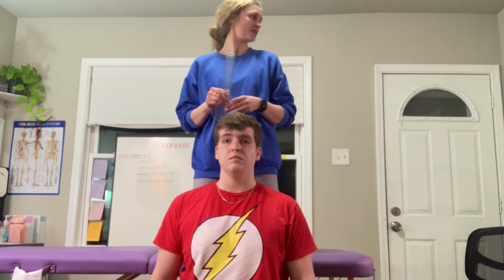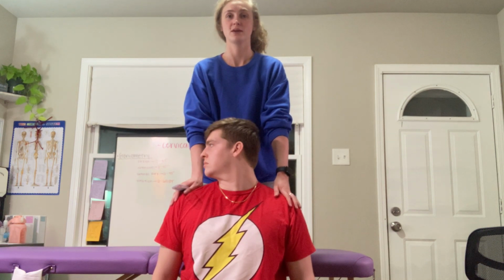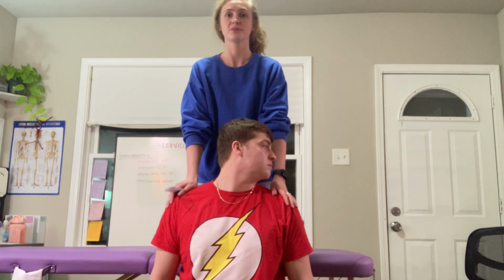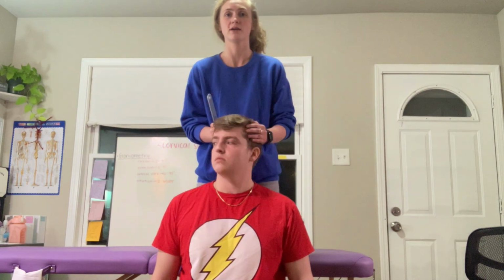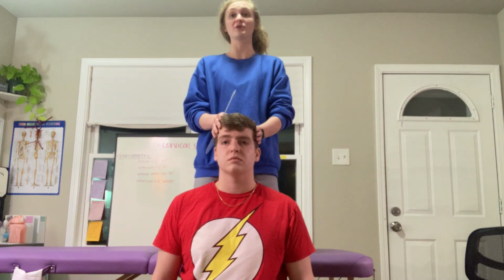and then we're going to go towards the left-hand side without moving our trunk. Okay. Whenever you're ready, we can go towards the right-hand side. There we go, and back, and now towards the left-hand side. Back. Let's try to just move the head. And back. There we go. Much better. All right, now we are going to be taking the measurement.